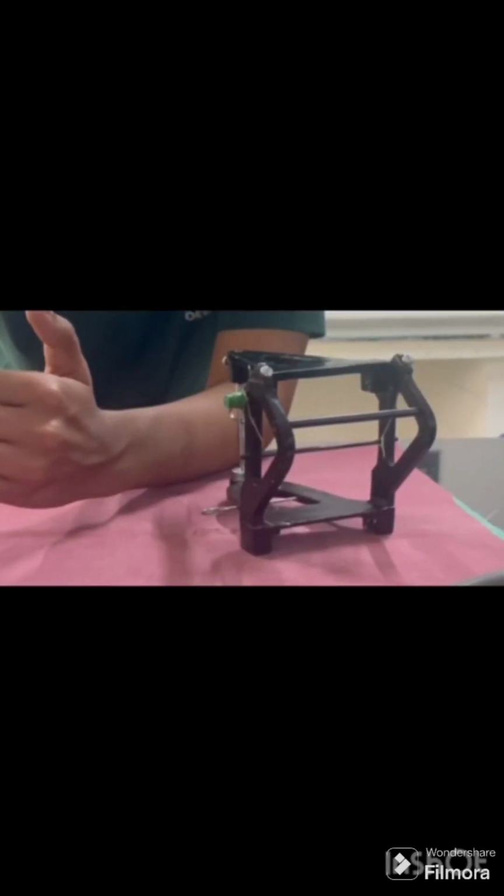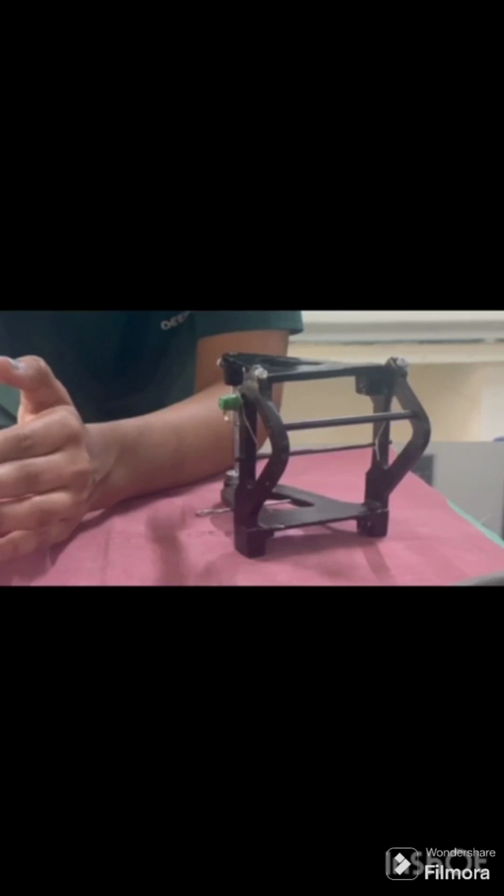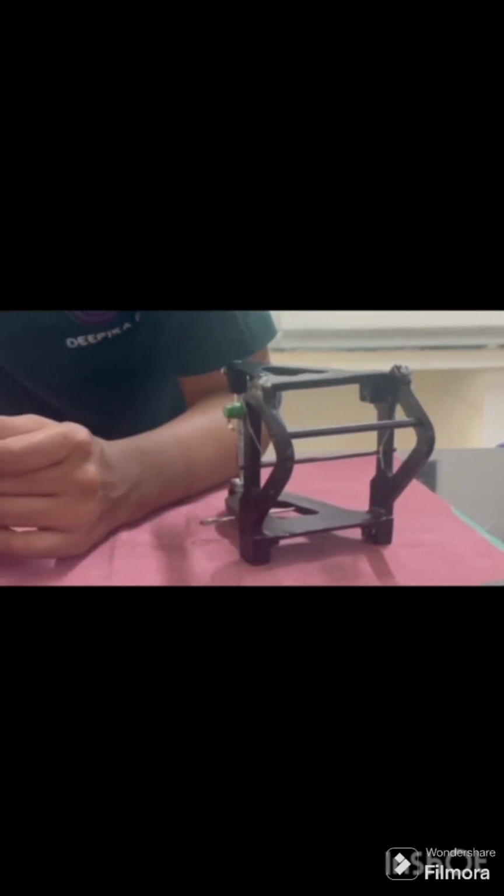Class 2B which includes articulator. And coming to class 3, class 3 is divided into class 3A and class 3B, and class 4 is divided into class 4A and class 4B.